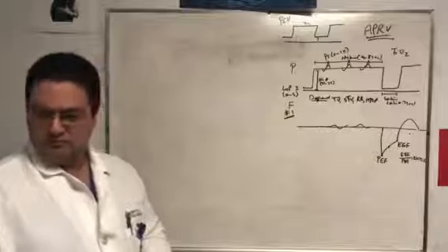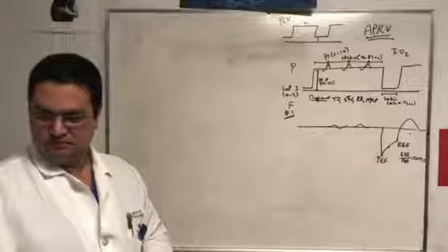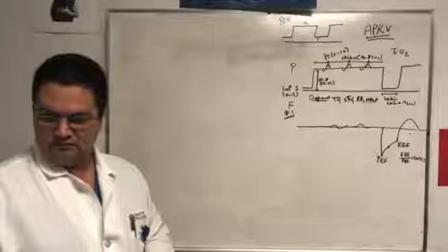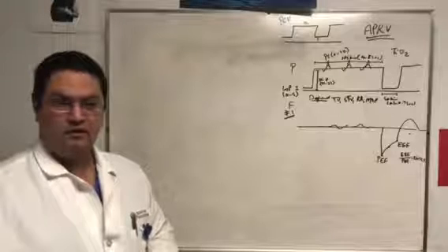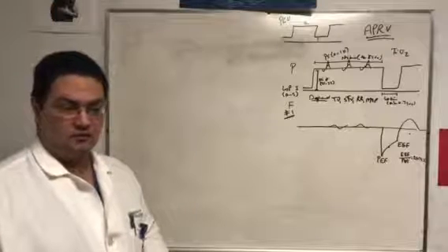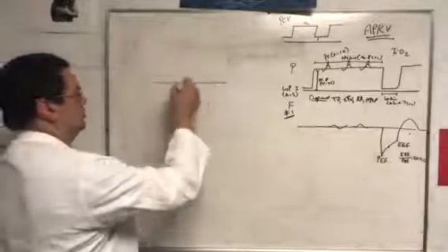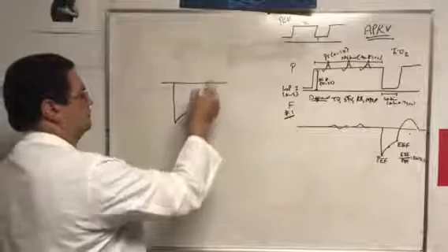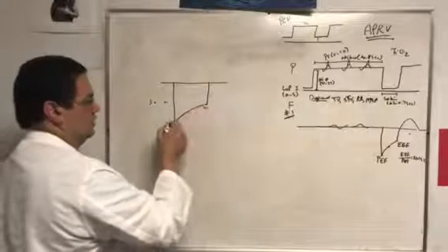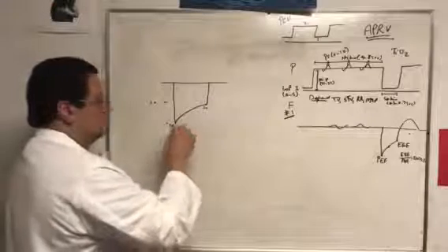That would mean that the end expiratory flow is more than the peak expiratory flow, so their resistance is increasing probably. So it could be that there's more obstruction, like resistance to the flow, or it could be that they recruited. So let me just show you. So this is it, right? This is 50% of this. This is 50, and this is 100, for example, right? Now at night, you come in and it's 60%.